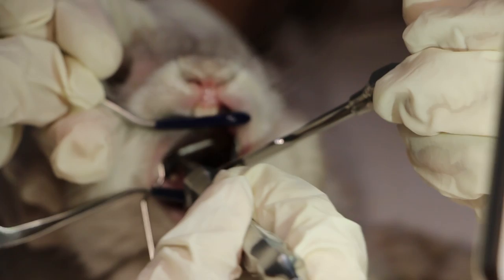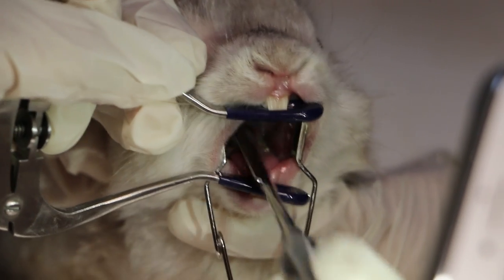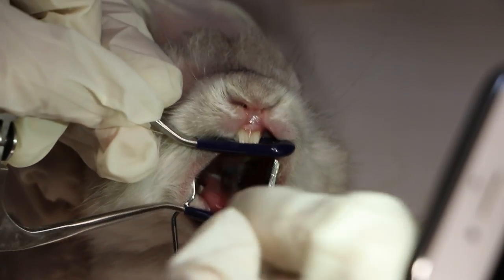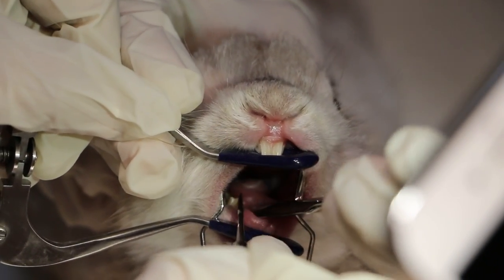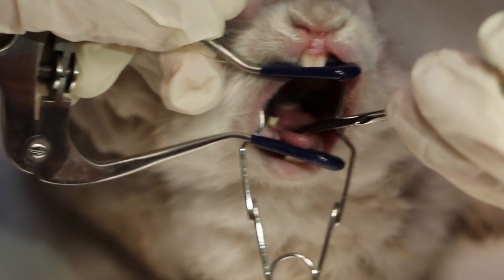Now you want to see the molar — angle your light onto it. The next instrument is to file the sharp edges. Normally you just file it down, especially if there are molar spurs. Let's show the file instrument so you can see how it looks.